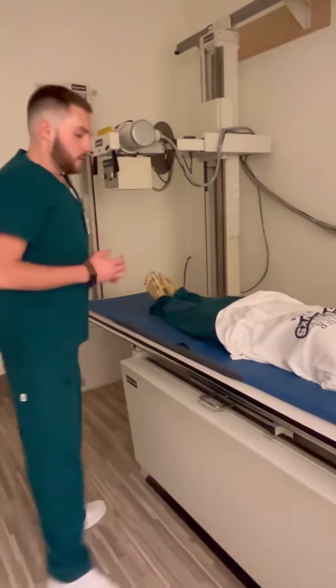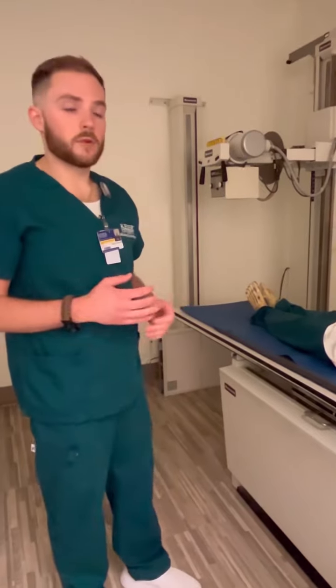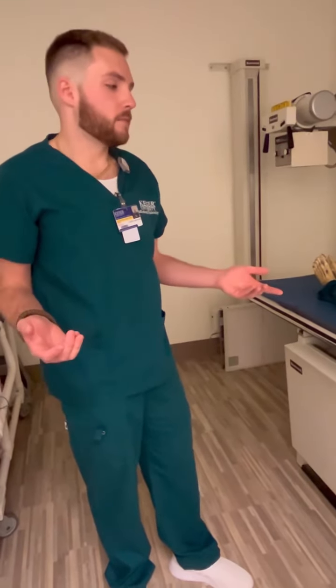So once this is set up, I would go and grab my patient from the waiting room or wherever they're being held at. I would confirm their first name, their last name, check their wristband, ask for their birthday to make sure absolutely this is the right patient I'm doing exams on. Then I would introduce myself before that. And then I would want to make sure they know what they're getting done.